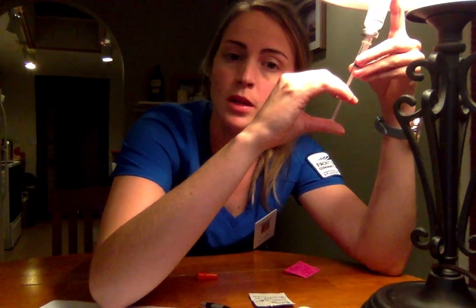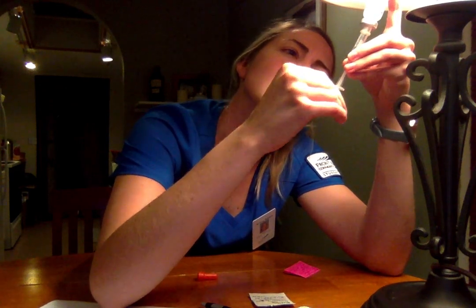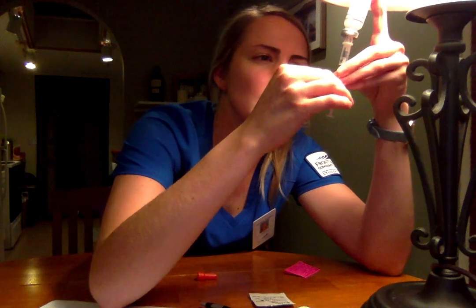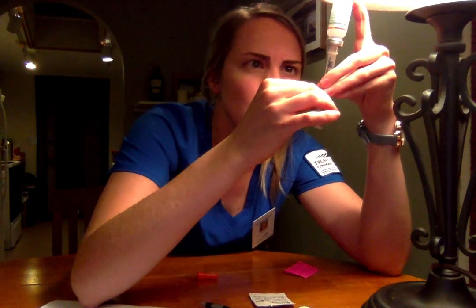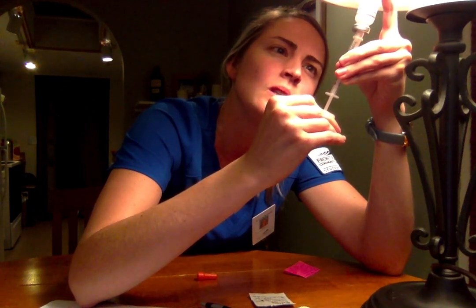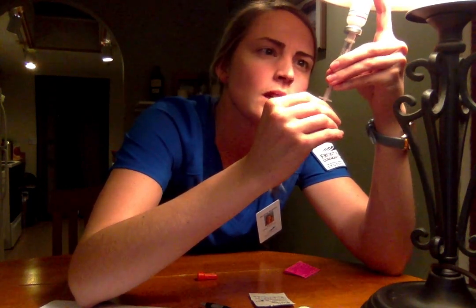Okay, see a bubble at the top and I'm going to push. Gonna get it.